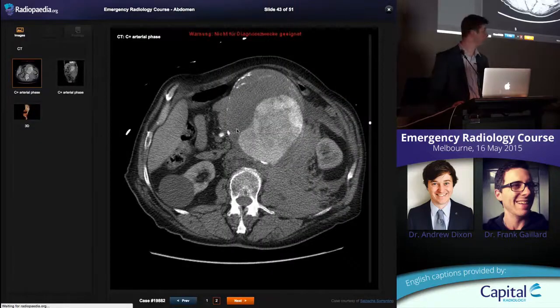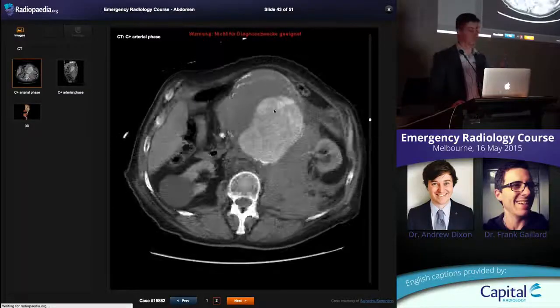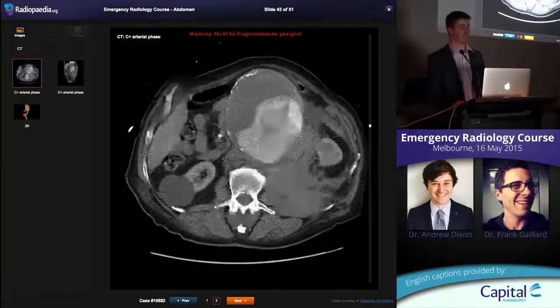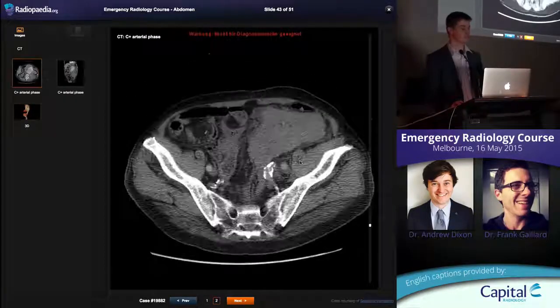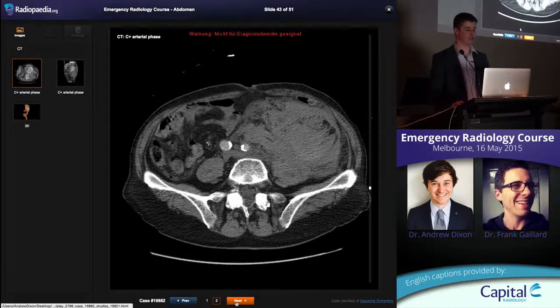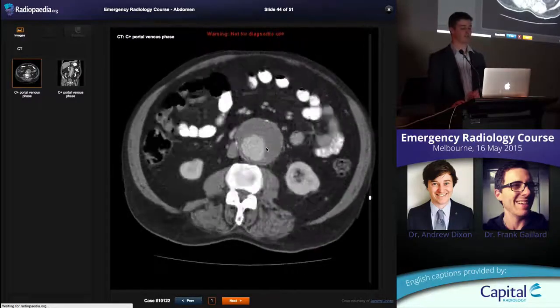Okay, I think it is just about, it is 1 o'clock. So I was going to finish with vascular stuff in the abdomen. First thing to say is that abdominal aortic aneurysms are really obvious when they rupture. You barely even need contrast in there because you're looking for this retroperitoneal hemorrhage. Okay, easy, don't need much help diagnosing that. Just get an urgent CT scan and you'll get the answer.